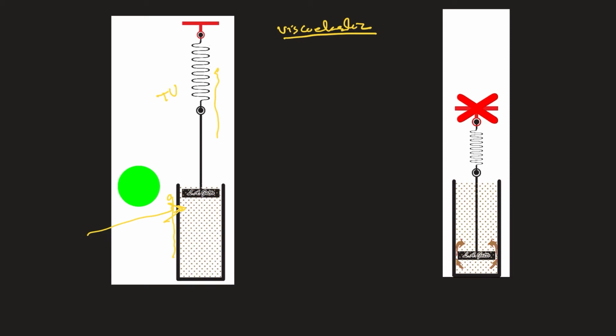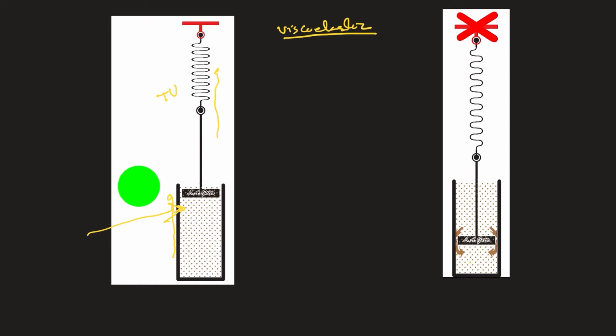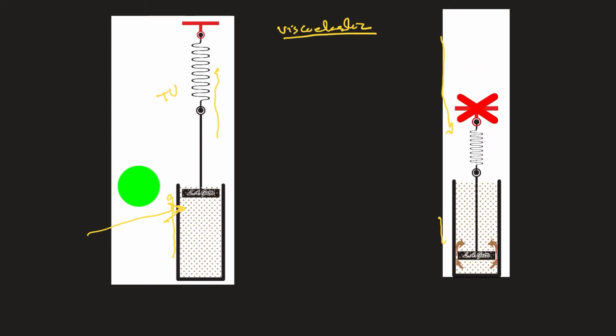And this is the expiration. See the spring going up, the tidal volume. See the release of the spring now. This is the release phase. See the shrink is again slow. Again, see now the release. See the expiration now, the release phase. See quickly, but see the dashpot moving slowly.